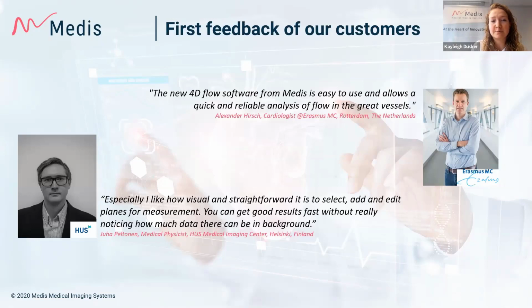So we will, of course, keep improving our 4D-Flow application, but I would like to show this feedback from our customers to you as well. One is from the cardiologist at the Erasmus University Centrum here in the Netherlands, in Rotterdam, and the other one is from a medical physicist from the Helsinki University Clinic in Helsinki, Finland.